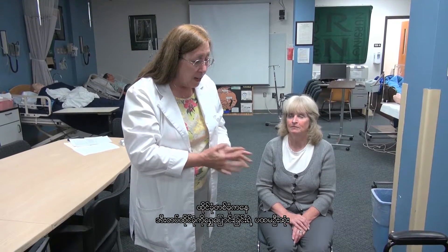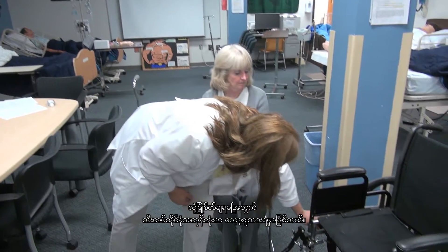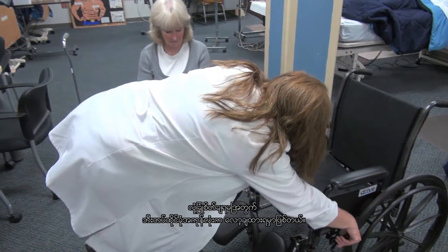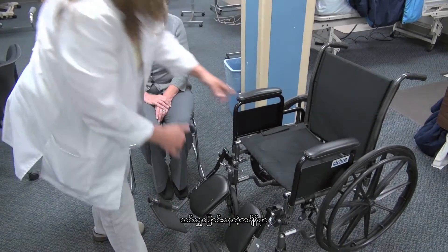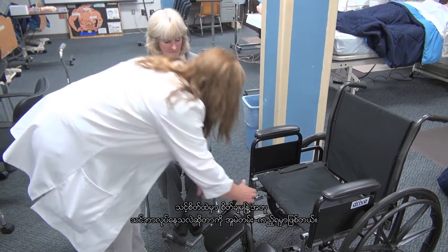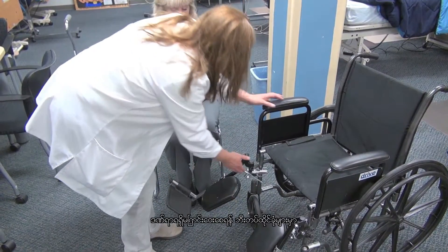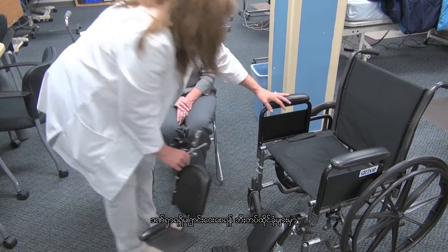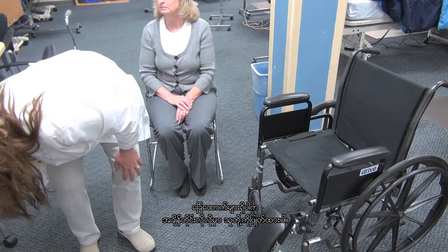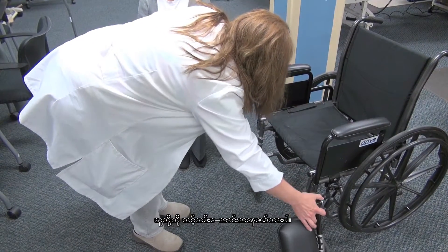The first principle in transferring from a chair to a wheelchair is look at your wheelchair. All wheelchairs are different, but all wheelchairs must be locked before you transfer the person, for safety. Always look at what you're doing when you're transferring with safety in mind. Most times you want to take the wheelchair legs off of the chair to avoid injury. Put them out of your way so you're not going to trip on them.